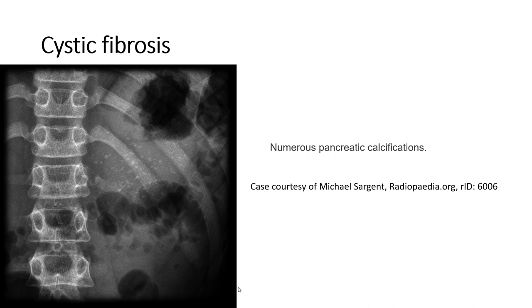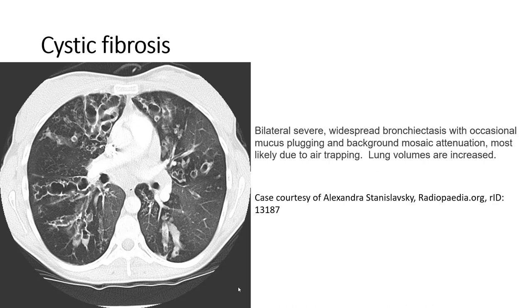On the abdominal X-ray, we can see numerous pancreatic calcifications in a case of cystic fibrosis affecting the GI system. The CT shows bilateral severe widespread bronchiectasis with occasional mucus plugging and background mosaic attenuation, most likely due to air trapping. Lung volumes are increased, consistent with cystic fibrosis.